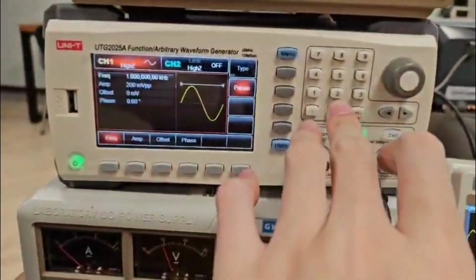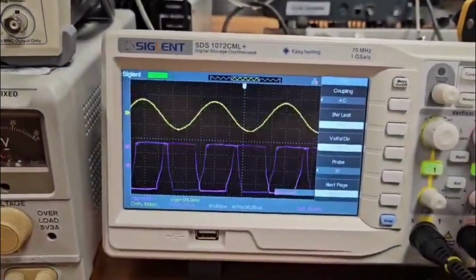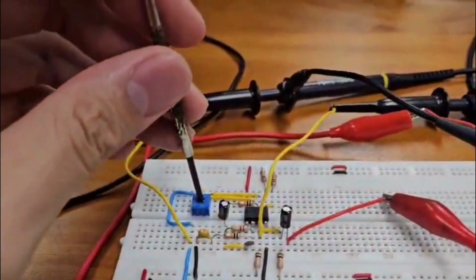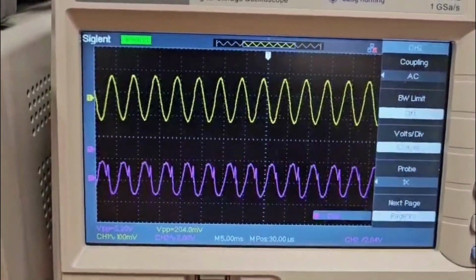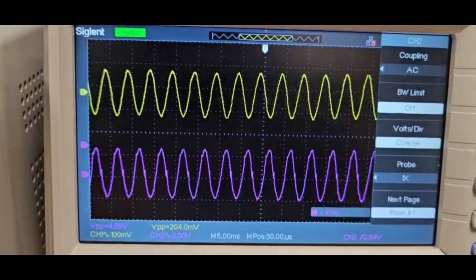So now I'll be changing the frequency to 200 Hz, and I'll try to trim until I get a perfect sine wave without any distortion or saturation. When I finally adjusted until I was satisfied, the VPP that I got was 4.68 volts.